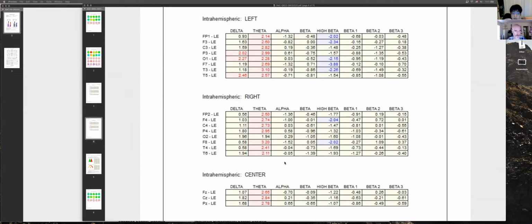But that's only like 0.6 standard deviations above average. Yes, but anything above 0.5 is interesting. Interesting? Yes. What about high IQ people? 0.5 and up. And a spread that's wide is interesting, suggesting that this number is not your actual speed.